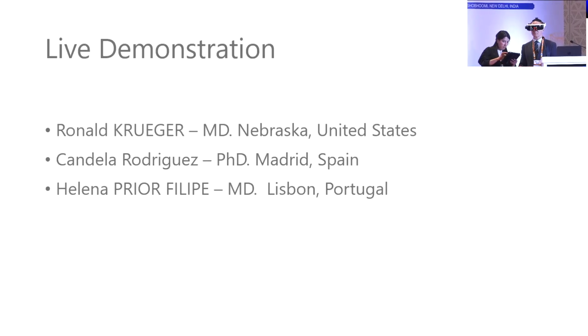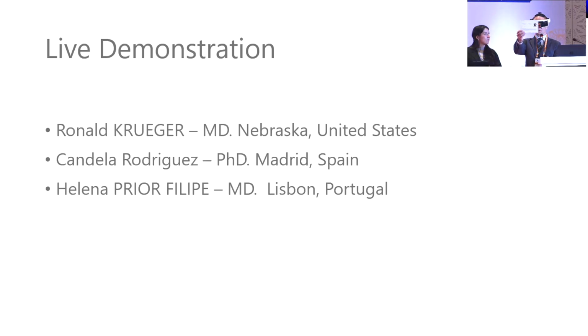Okay, let's try another option. And this would be a mix and match. Okay, mix and match. So I can see the distance pretty well. Maybe it's not quite where it was before. And now the near vision. The near vision is also pretty good, but I don't think it's superior to what I had when I was just wearing the EDOF. So maybe I'm one of those people who just needs a little bit of extra range of near without having the full range.